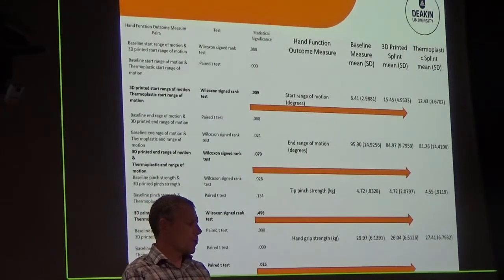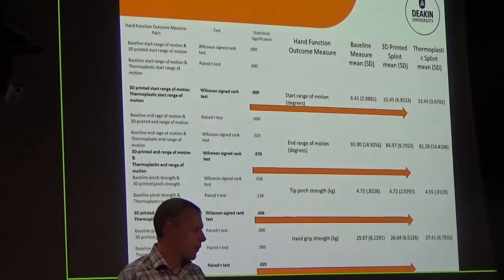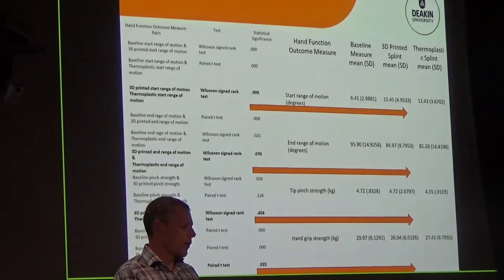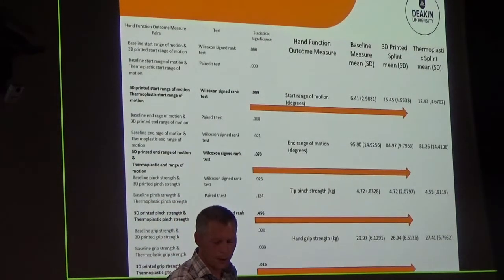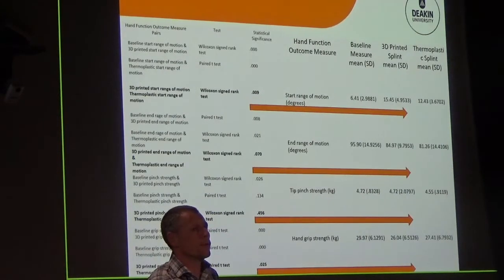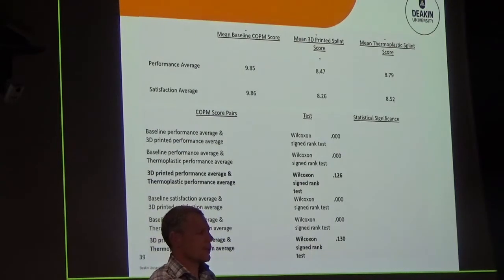The 3D printed range of motion at the end point, 0.07, meant there was no difference between them. For pinch strength, there was no difference between them. And for grip strength, there was a difference between them of about a kilo mark. So we had both statistical results, but also more importantly, clinical results to show the differences or lack of difference between the two splints. For the Canadian occupational performance measure, we did the same testing, and basically the height of the bolded ones there shows that there was no statistical differences between the thermoplastic and 3D splint. Those scores you can see there.